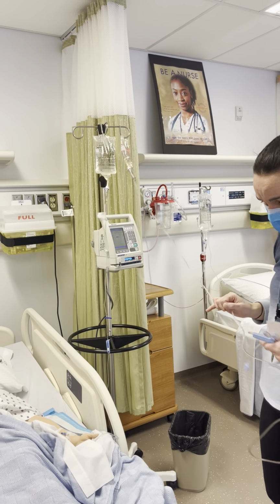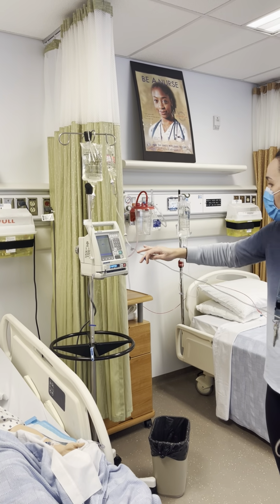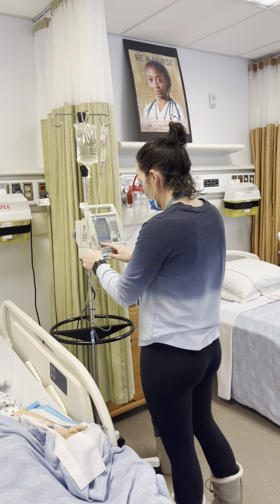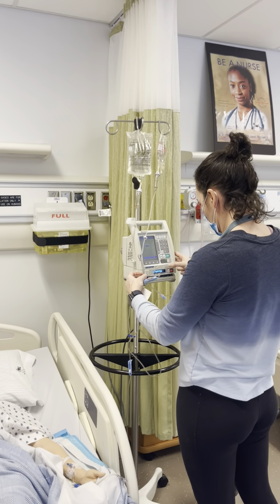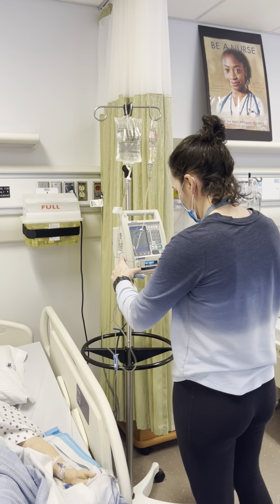So now we can go ahead, he's agreed to have his insulin, so we can go ahead and set up our pump. So we're going to open up our pump.